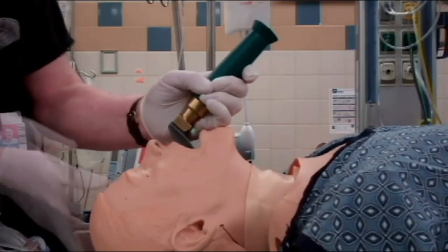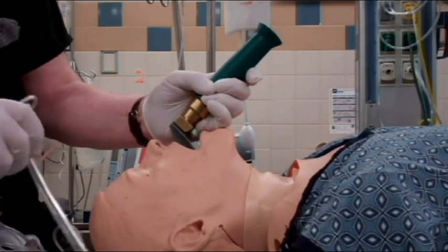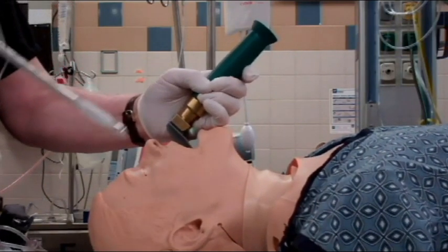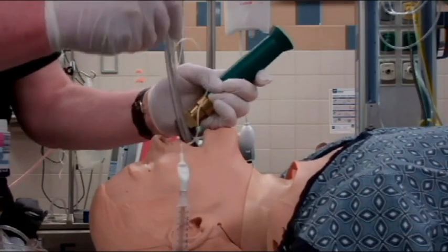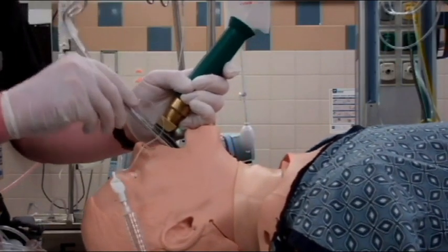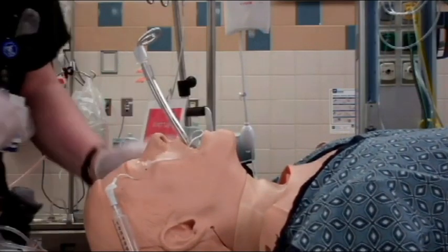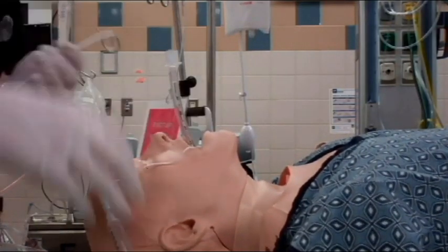When you have a good view of the glottis, advance the endotracheal tube along the corridor you have created on the right side of the patient's airway, pass the tip of the tube through the glottis, and we aim to place the tip of the ET tube at the mid-tracheal point by advancing it until the 23 cm mark or the 21 cm calibration marks are level with the lower incisor teeth in men and women respectively.